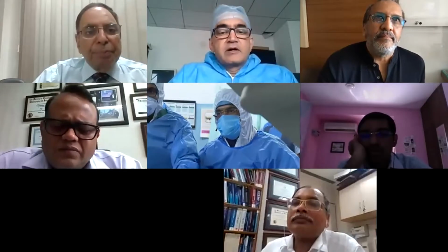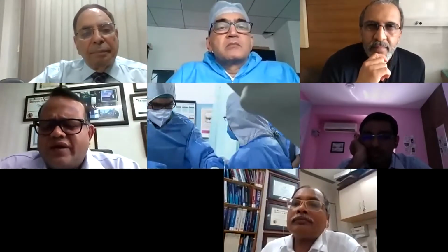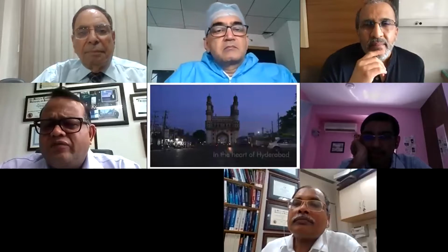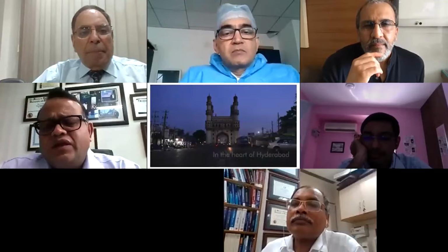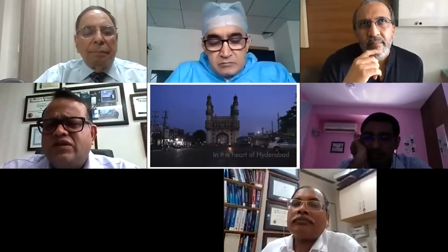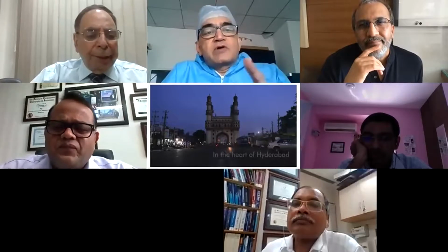So, I agree with Kirti that 8 French makes it very easy, and instead of going for the 3 stent, imaging can very well guide us to come out with the 2 stent for a trifurcation lesion and a balloon dilatation to one of the branches. So that's the simple strategy instead of going for a complex one using a 3 stent for a trifurcation lesion. That's my comment. Dr. Kaul, I have a comment to make.